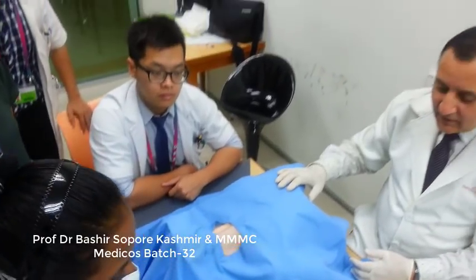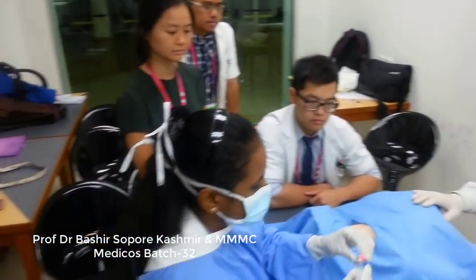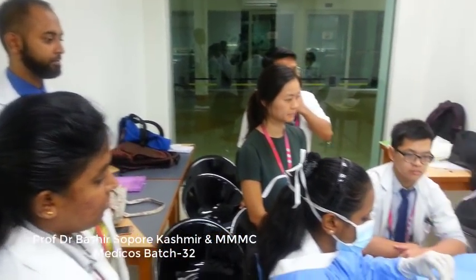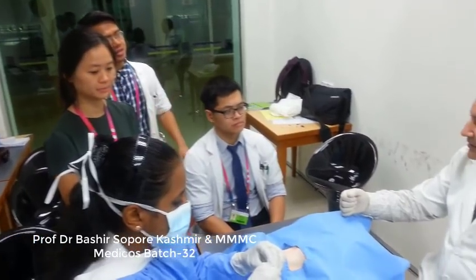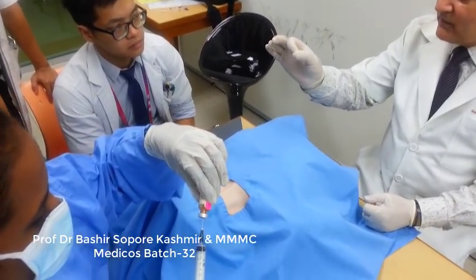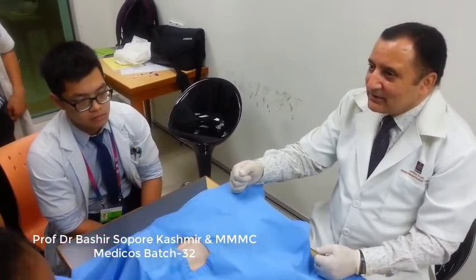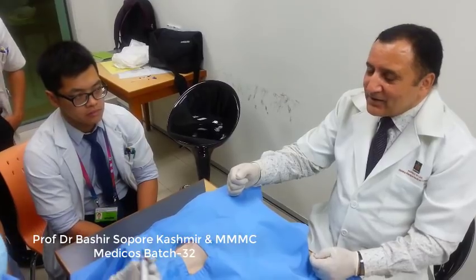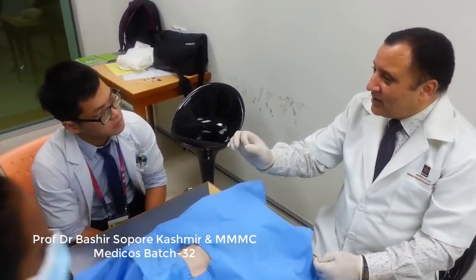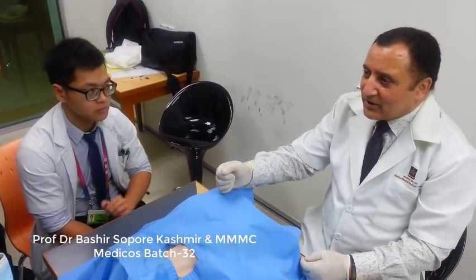Area is draped. Then once the area is draped, we take the xylocaine 1%. Now I will tell you how deep the jugular vein is. The diameter of the jugular vein is 2.5 centimeters. And how deep is it? It is very superficial. It is only within 2 centimeters that you should be able to find the jugular vein.